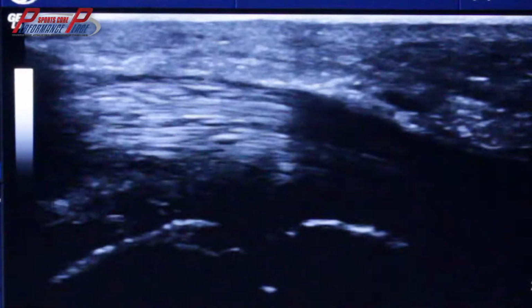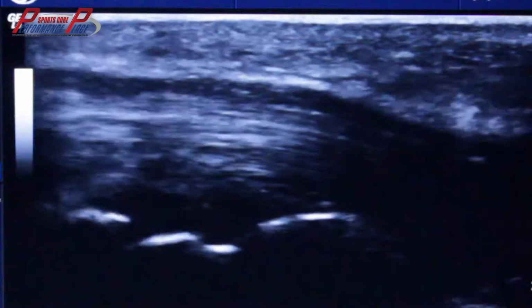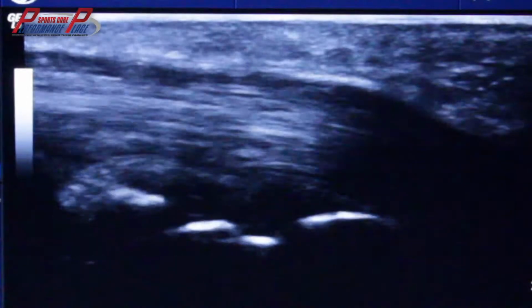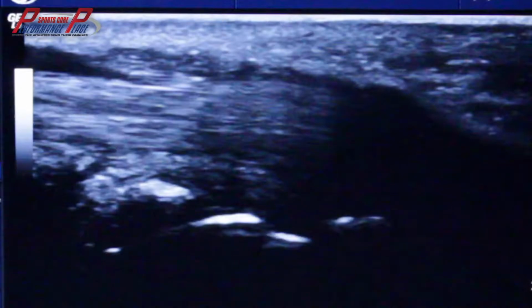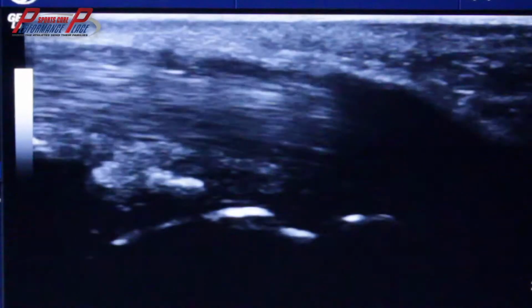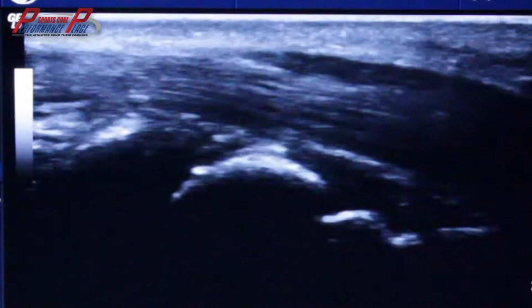or towards the body. Now, just to get a reference point again, so here's that nerve bundle at the top. It looks like a black line, mainly because nerves aren't as dense. We call this a hypoechoic appearance. Now, you're going to notice that as I move the fingers, the nerve kind of moves with it. Let's see if I can get a better picture here.